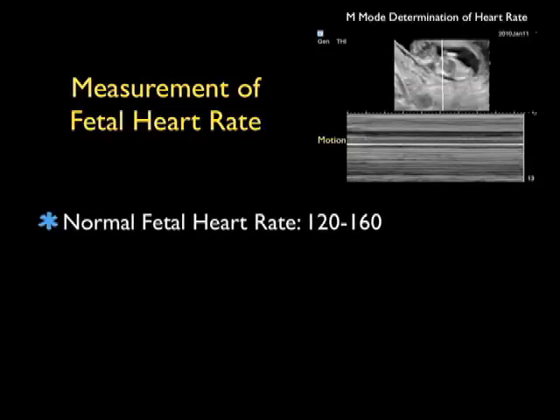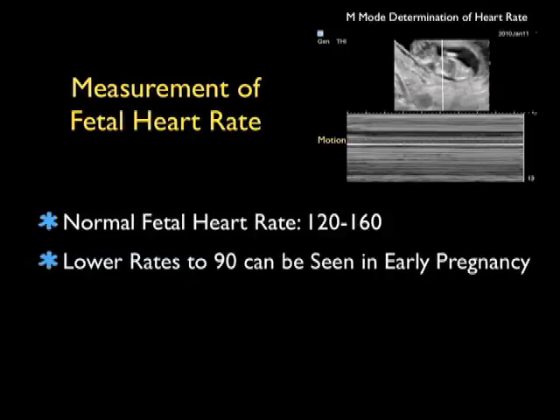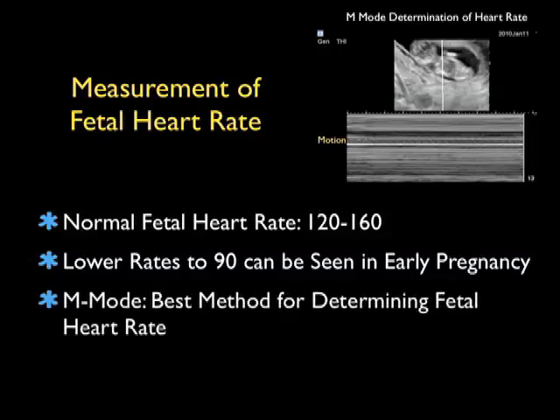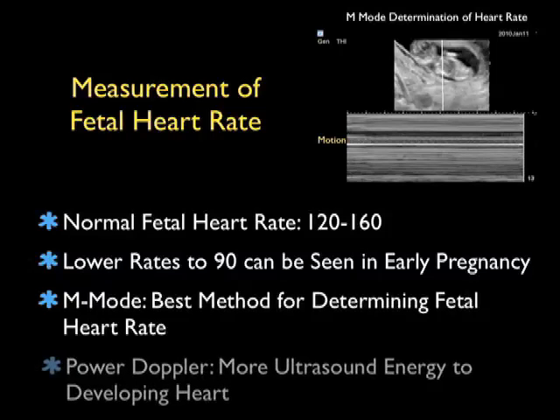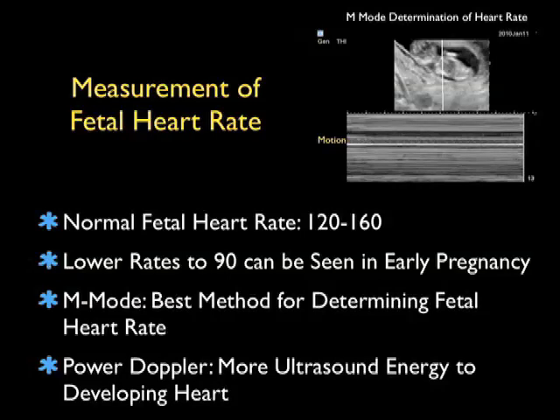In addition to measuring the gestational age of the fetus, another very important concept is to get a measurement of the fetal heart rate. Normal fetal heart rates will range from 120 to 160 beats per minute, but lower rates down to 90 beats per minute can be seen in early pregnancy in the early parts of the first trimester. M-Mode is the best method for determining fetal heart rate. Power Doppler, in contrast, gives more ultrasonic energy to the developing heart. Thus, M-Mode is the preferred way of measuring the fetal heart rate at this time.